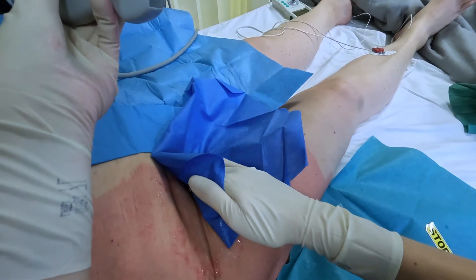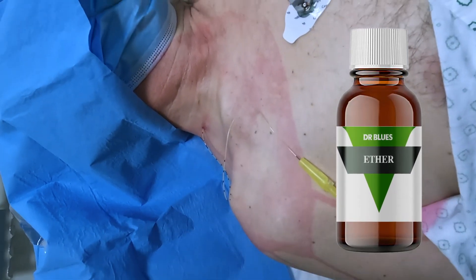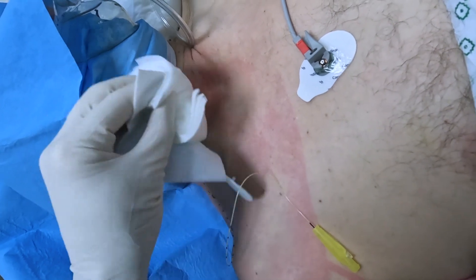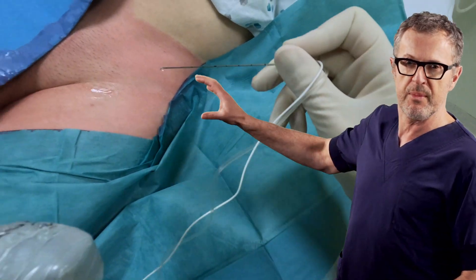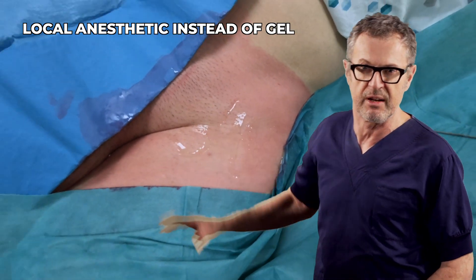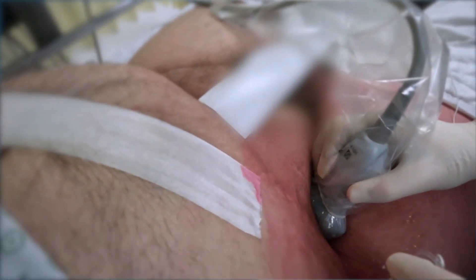Not using gel is more time-efficient and avoids the difficulties with cleaning the skin after the procedure, particularly with inserting perineural catheters, which are quite difficult to secure if there is any residual gel. We will see two pain blocks where the application of a small amount of local anesthetic on the skin while flushing the syringe and needle system was sufficient to obtain excellent images, even in obese patients.